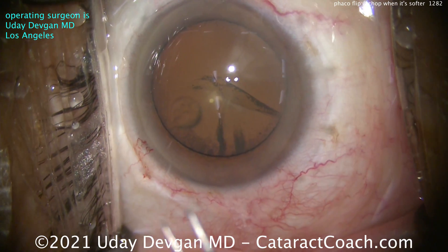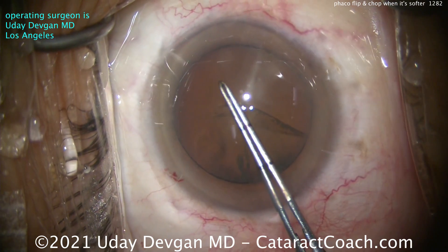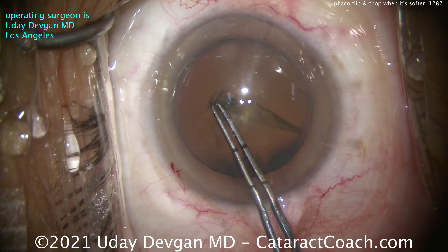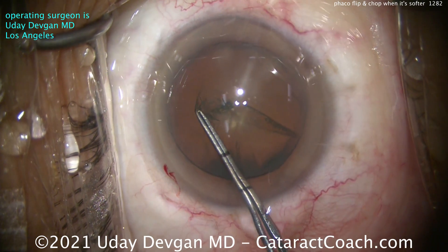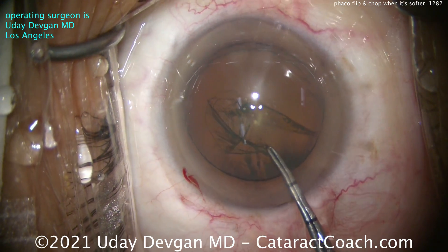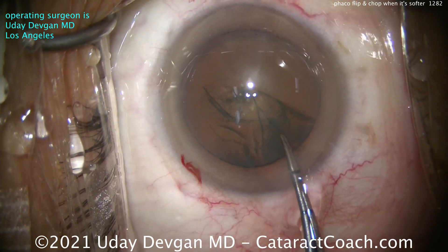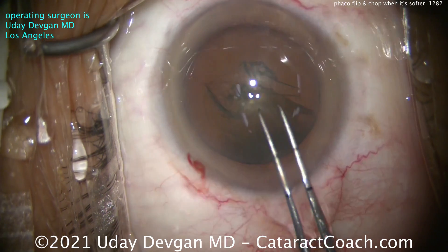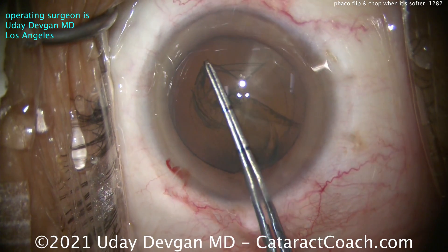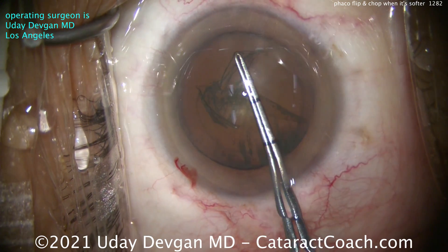Now it's time for the rhexis. In this case, we'll do a 5mm rhexis. You don't need it as big because you don't have as much nuclear density. We'll poke in here in the center and get that rhexis going — counterclockwise, which is my usual — aiming for somewhere between 5 to 5.5mm. A 5.0mm is okay in these cases because the nucleus is a little bit softer; you'll be able to prolapse it up out of the bag and get that flip done.